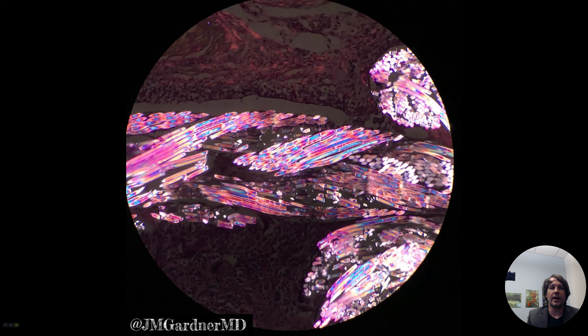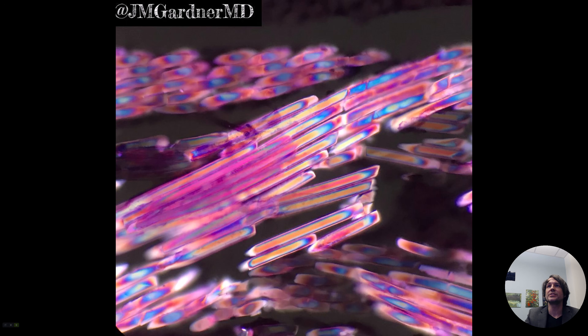Lots of foreign exogenous material will have birefringence — or kind of this glowing bright appearance under polarized light examination. But I think this synthetic vicryl suture is the real winner because it has such a bright, vibrant rainbow of colors. Here's a closer look — that's just stunning, right?